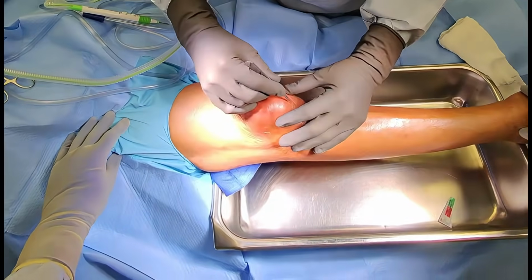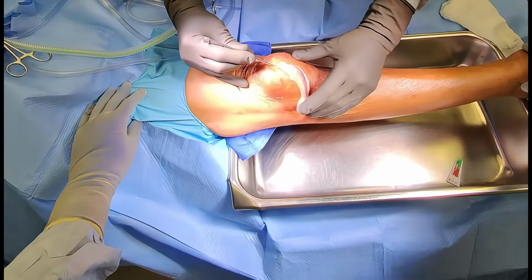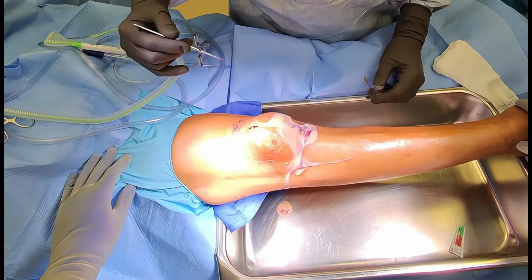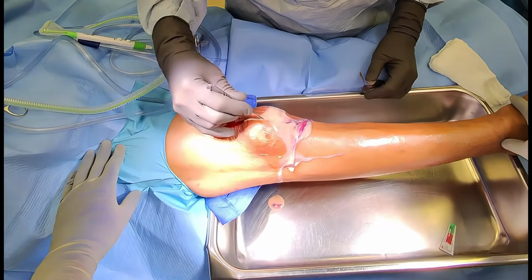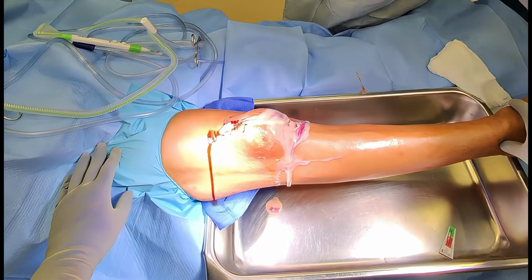Alright, incision. Oh, yeah. I don't think that was going to get better on its own. Taking a knife, we've incised the skin. The pressure of the pus collection caused a mountain of infectious goo to come rushing out.